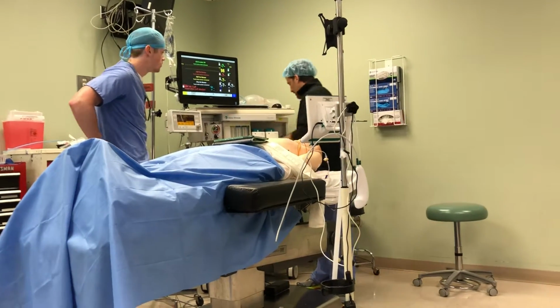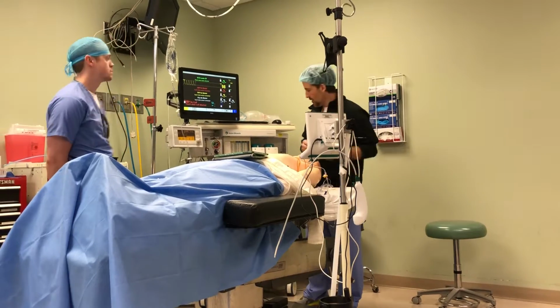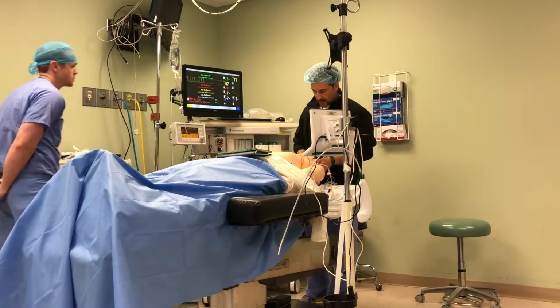Gonna come in, get this ready here, pick up my hands. So, all right, so we're gonna get connected to our monitor.